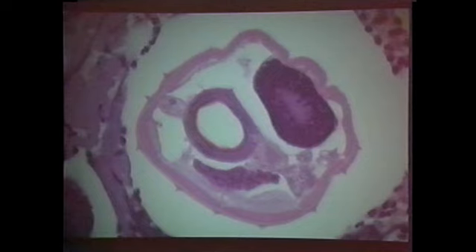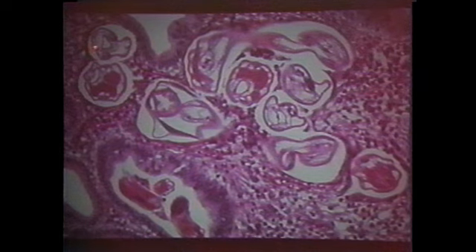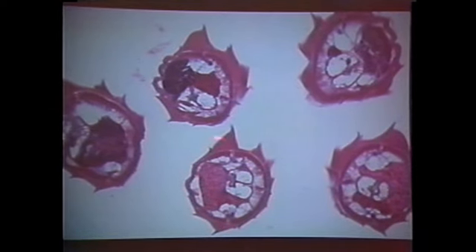You can use these minor morphological characteristics. This is Ostertagia. I don't know if you can see it, but they have regularly spaced external ridges here. It's a trichostrongyle, a very small worm. Look at this one. This is Nippostrongylus from a rat. It's a trichostrongyle. It has these external cuticular ridges of unequal shapes and sizes.